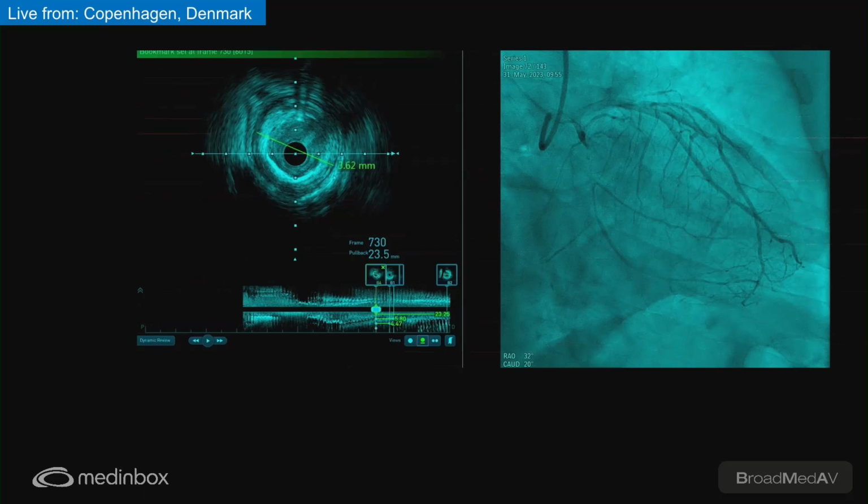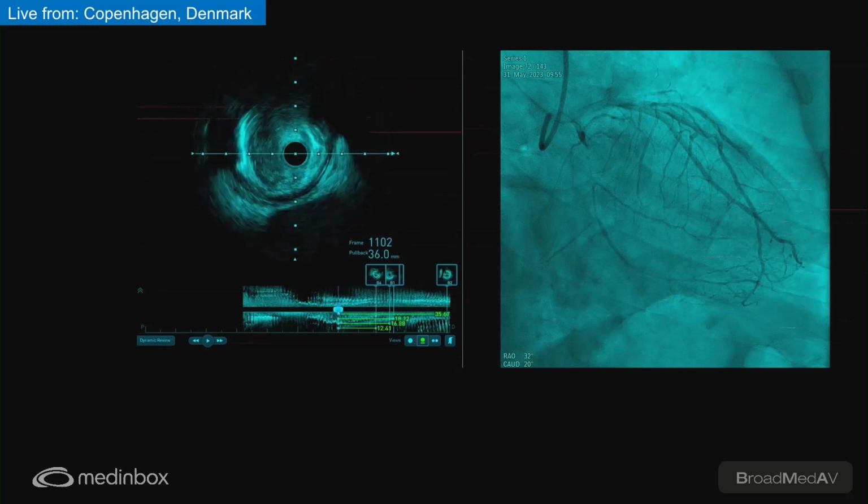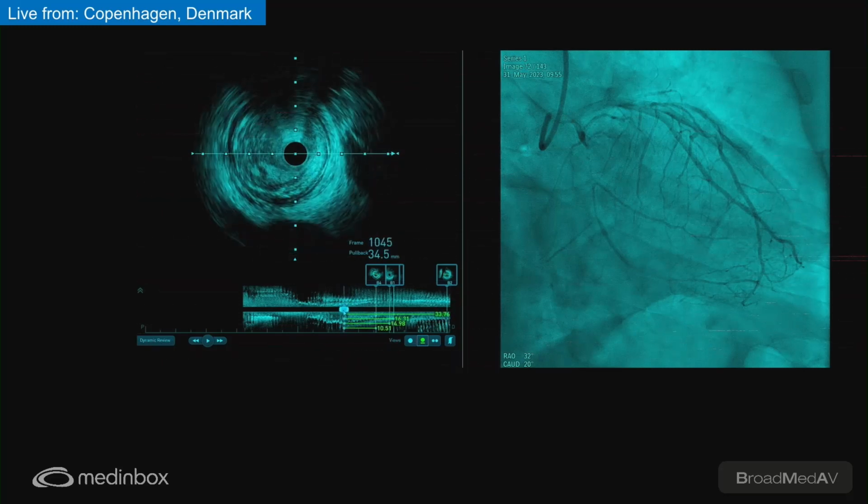And here at the occlusion site it's 3.5. But with the 2.75, you go proximal to the bifurcation, 8 millimeters, do a POT, and then go with the bigger stent. You can take the stent up to 2.75, and you can take it to 3.5 with a POT.